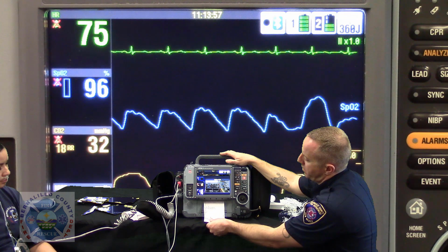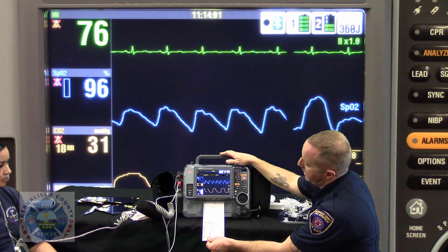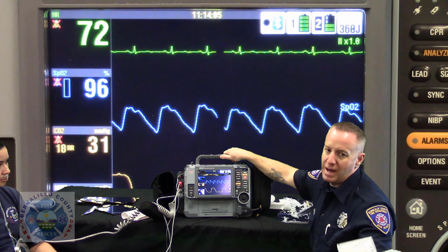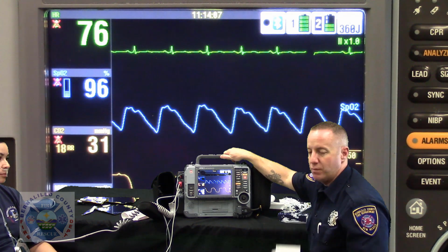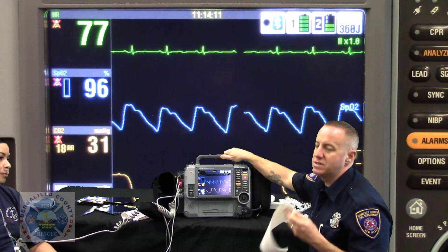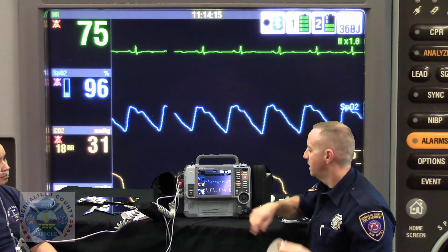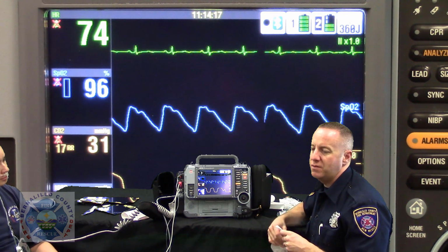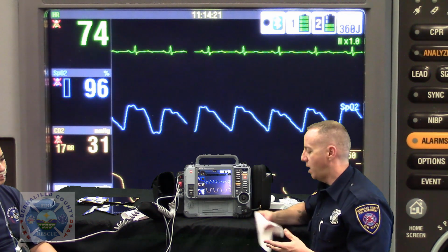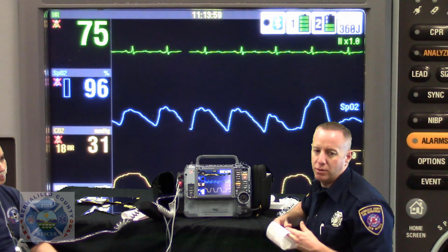And without interrupting the clinical interview in the middle of our assessment here, I can basically hand off a copy of vital signs to whoever's leading the interaction. And if we want to burn off another set of vital signs to the transport agency, they know exactly what time we took our vitals. Any events we put in for giving any medication or starting IVs or starting oxygen, all that can be passed on to somebody without really 5 people in the room talking.